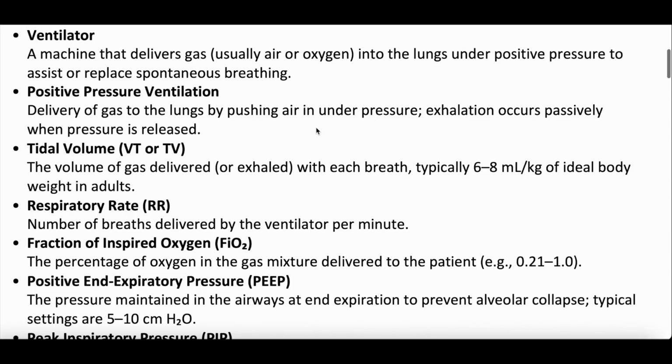So in all these modes, you provide an inspiratory pressure. Sometimes you set the inspiratory pressure. We'll talk more about that. Sometimes you set a tidal volume, but that volume when it's being pushed into the lungs generates a pressure. But all the exhalation that occurs happens passively.